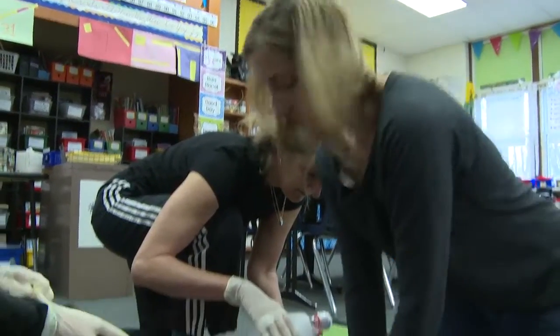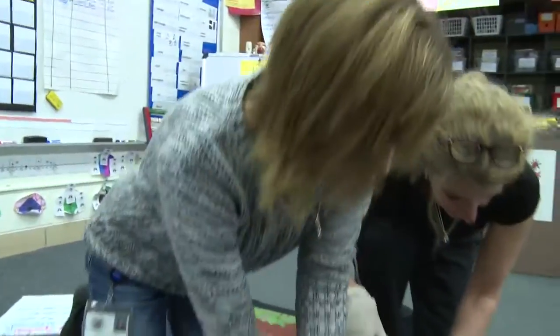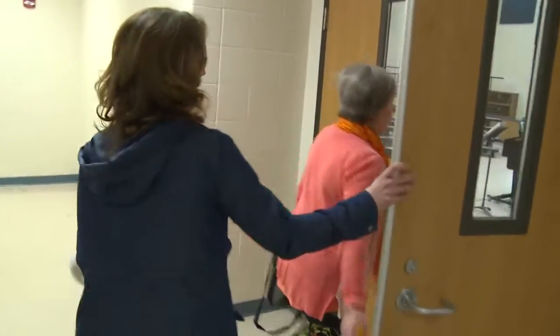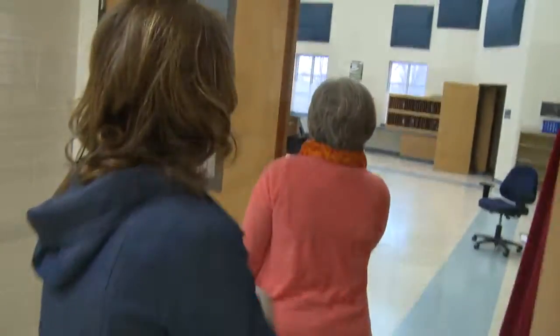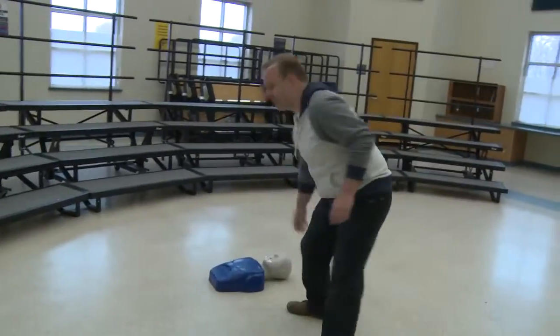A cardiac emergency response plan should be part of your school's comprehensive emergency response plan. Be sure that each team member is familiar with the location and content of this plan. Using a mannequin and a predetermined reality-based drill scenario allows the team to go through each step of the emergency response, just as they would in a real emergency.